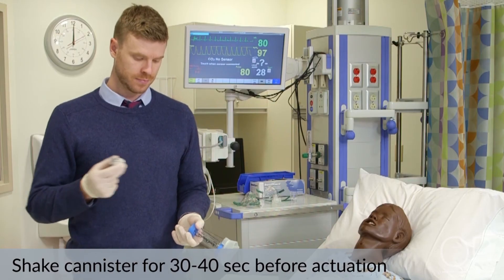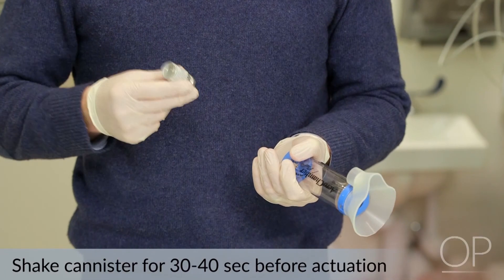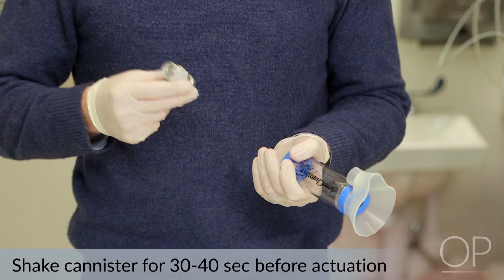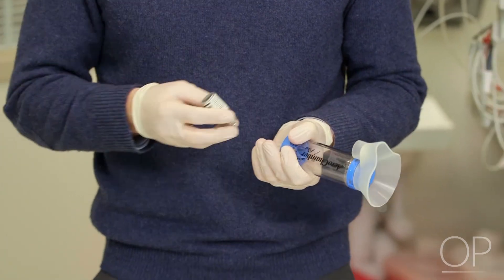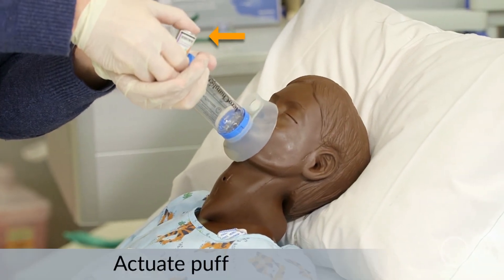One important thing to note when using MDIs is to appropriately and vigorously shake the canister before each actuation. About 30 to 40 seconds of aggressive shaking between actuations will ensure that the highest proportion of the prescribed dose on the canister will be administered to your patient. Place it back into the plastic holder, place it into our chamber, and let's actuate a puff here and give it to our patient.